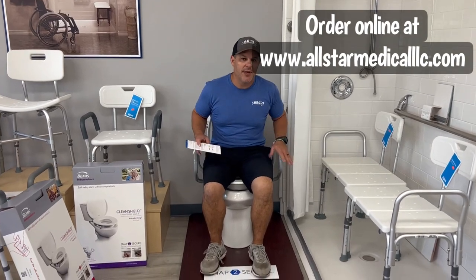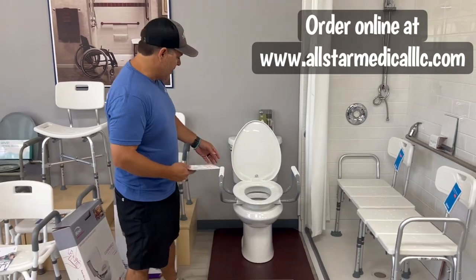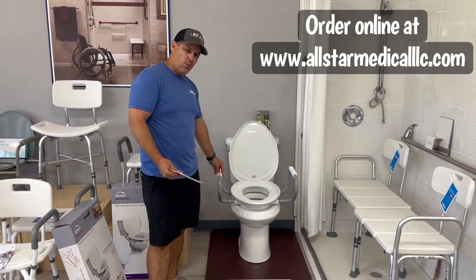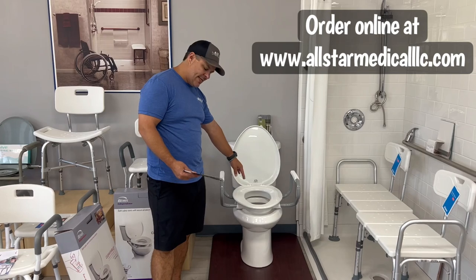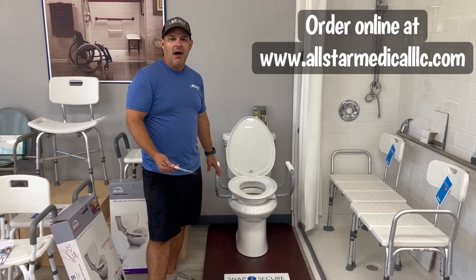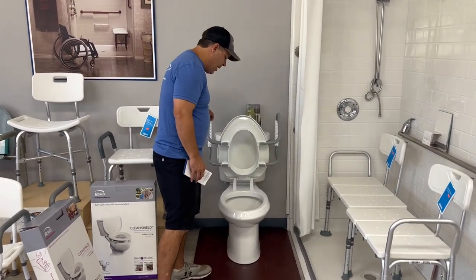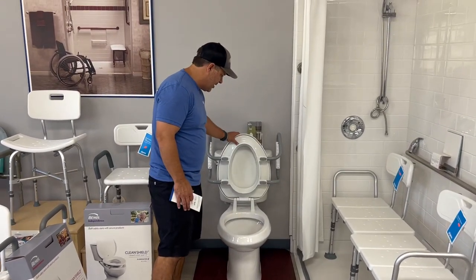The arms have a 350 pound weight capacity. They make this in elongated or round — the elongated is 18 and a half inches in the opening and the round is 16 and a half inches in the opening. It's a great item and I think we're going to have a lot of success with it.